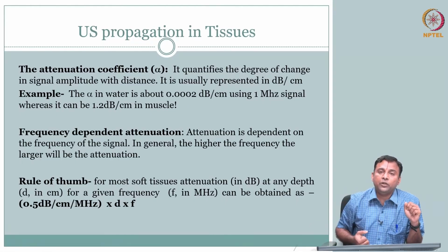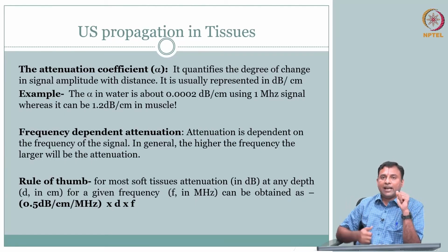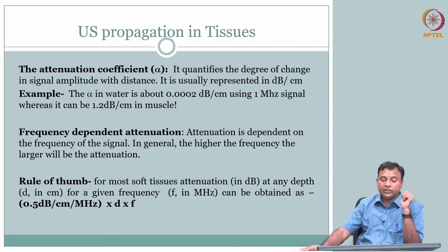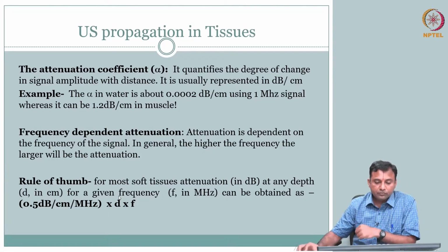you pick a frequency of choice. That's why you see, we will do that in instrumentation as well, but you will see that when you go for an abdomen scan, they will use a different transducer. When you go for some other, say, thyroid or heart echocardiography, they will use some other transducer. So all this changes, or the frequency they use is different, because the depth which they want to interrogate is different. Okay.